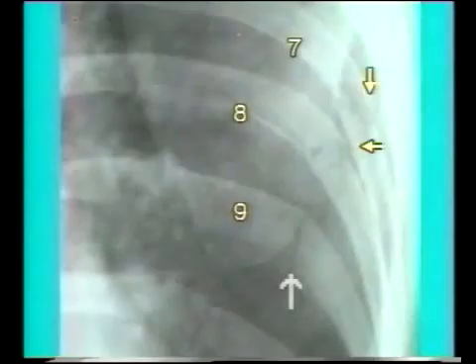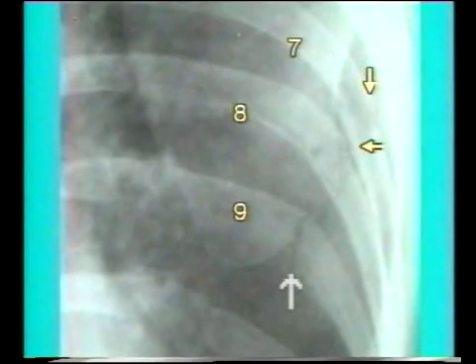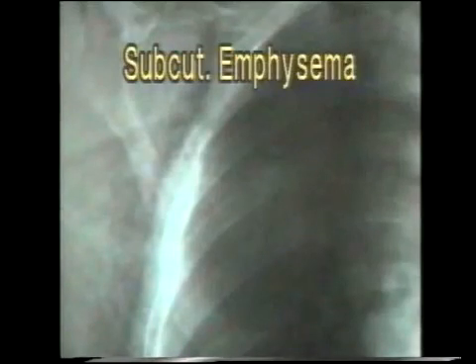This X-ray shows multiple fractures of the ribs — the 7th, 8th, and 9th ribs are seen to be fractured. This X-ray shows fracture of the right 3rd and 4th ribs with subcutaneous emphysema, that is air in the subcutaneous space.